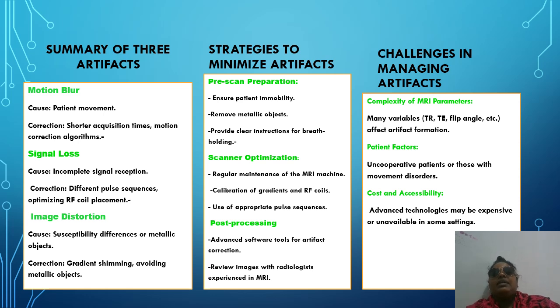Challenges in managing artifacts. Complexity of MRI parameters: many variables, such as TR, TE and flip angle, affect artifact formation. Patient factors: uncooperative patients or those with movement disorders. And finally, cost and accessibility. Advanced technology may be expensive or unavailable in some settings.